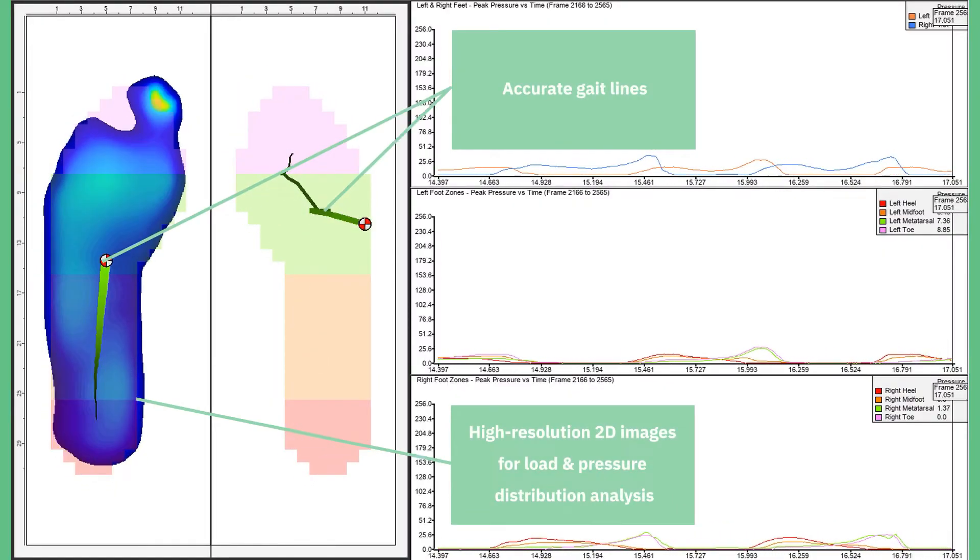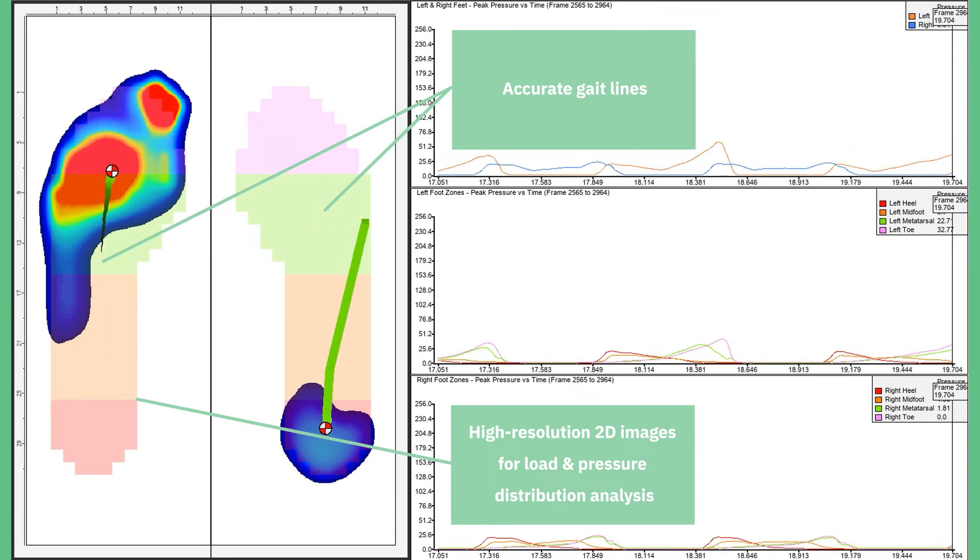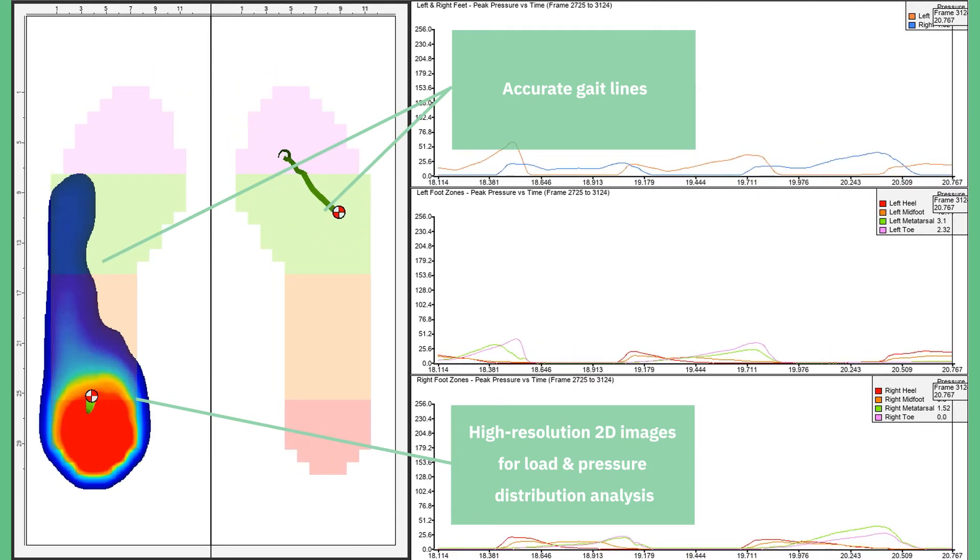High-speed collection up to 150 hertz ensures the entire plantar pressure and gait phase is captured to validate clinical assessment and treatment plans.